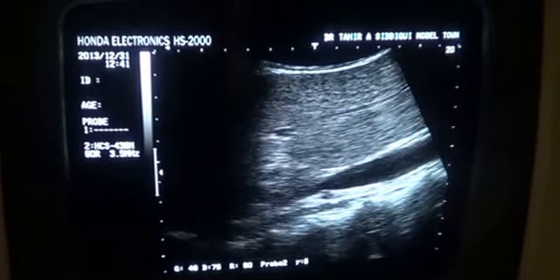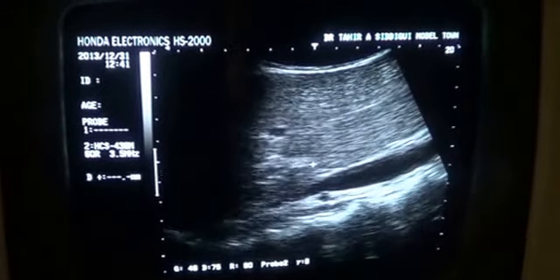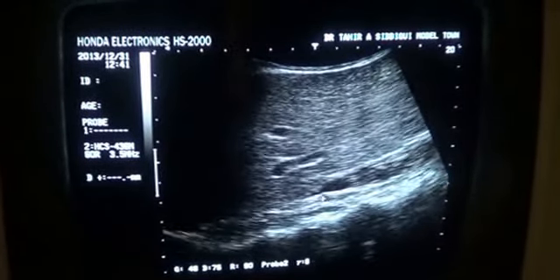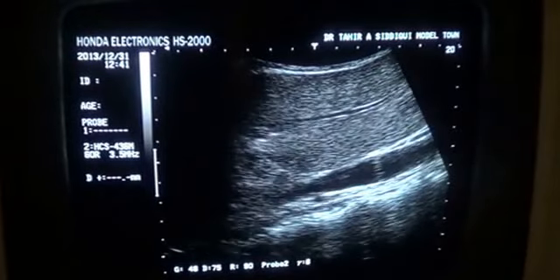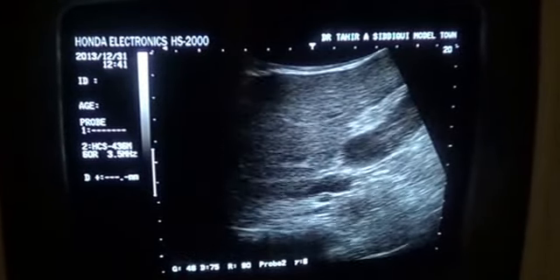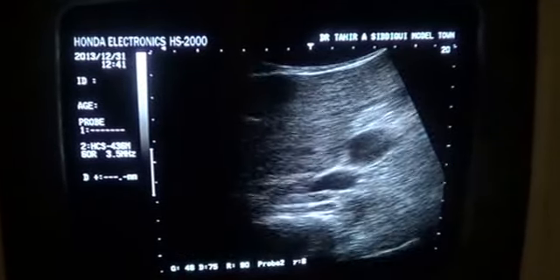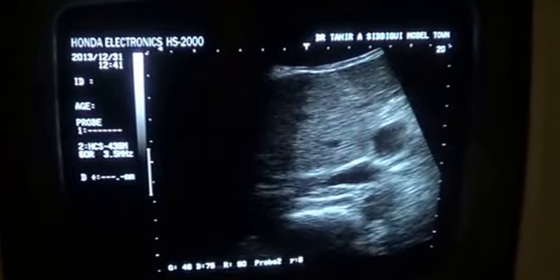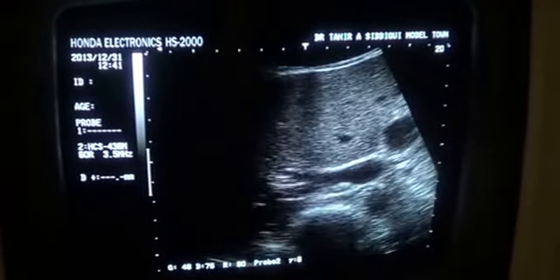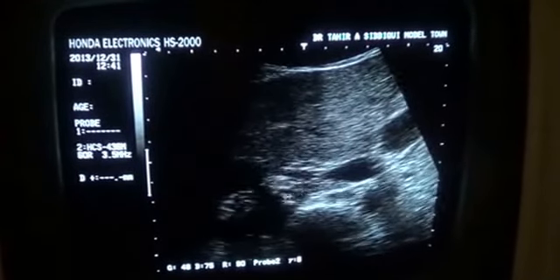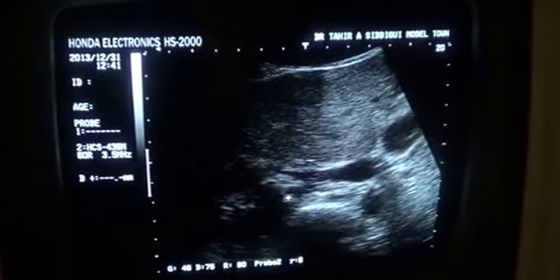You can see the tiny cystic area — you can see the pulsations in it. Now I'm going to move the probe 90 degrees to see if it enters the hilum of the kidney, and you can see that this section is entering the kidney.